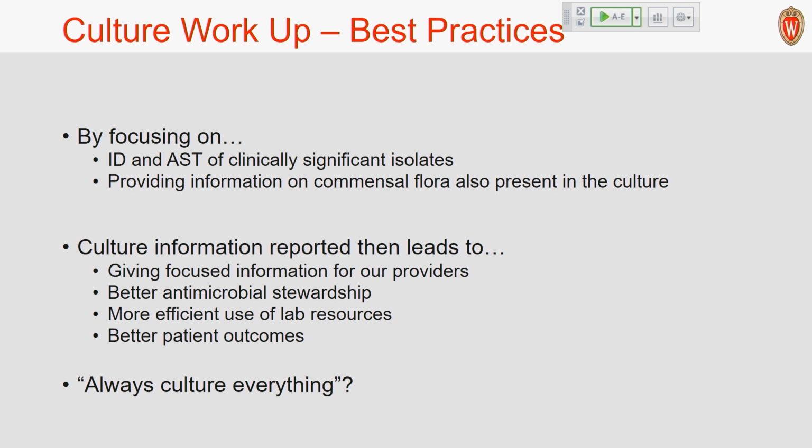We break it down into whether it looks like respiratory or GI or urogenital. We've had some techs say they'll have something above the diaphragm and culture some site and it's got GI flora or something. It's like, well, there could be something going on there, a fistula or something, or you don't know. Just tell it like you see it. And as I said, I won't go through the bullet points, but I really think having this directed approach, I don't think there's a right answer, but having some directed approach is much better than just culturing a lot of stuff and working it up.